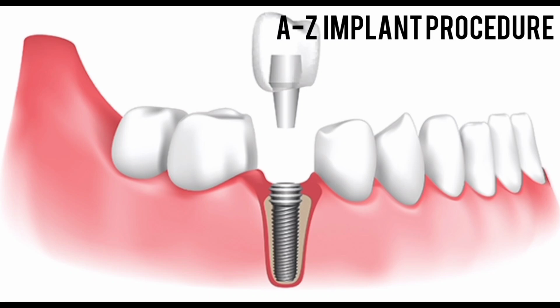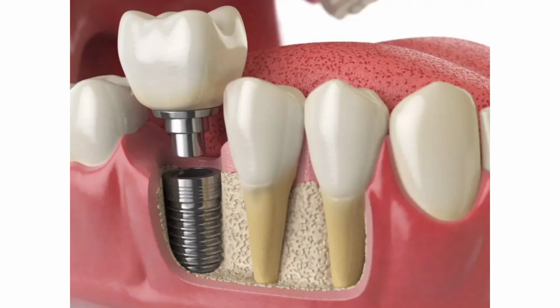A to Z of dental implant procedure. Before undertaking an implant placement, a thorough clinical evaluation of the patient's general and oral health is performed. Particular care is taken in high-risk patients in consultation with the general physician.